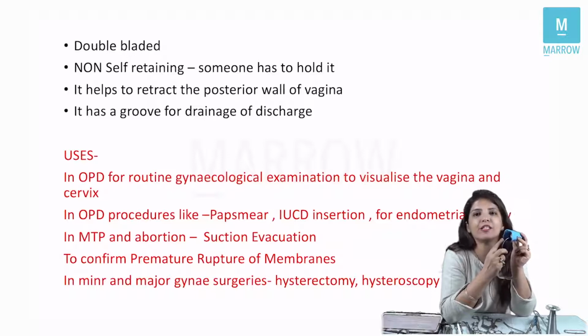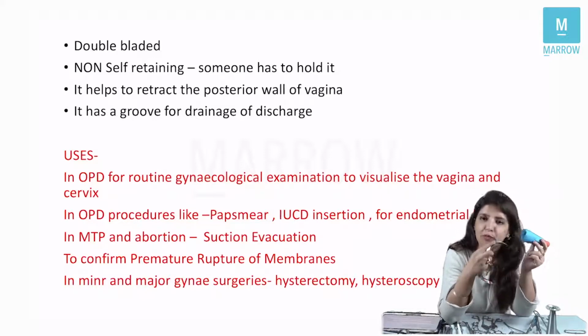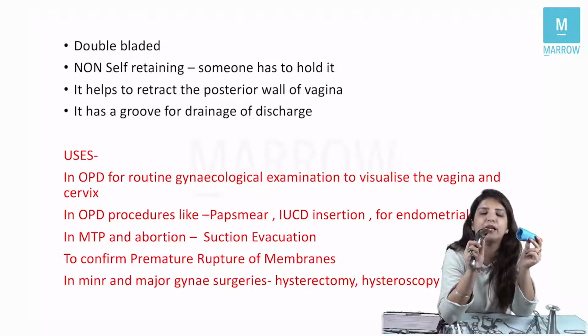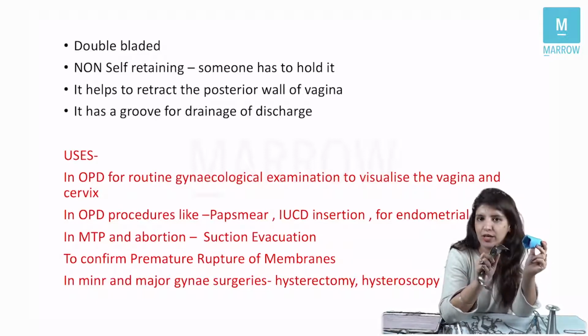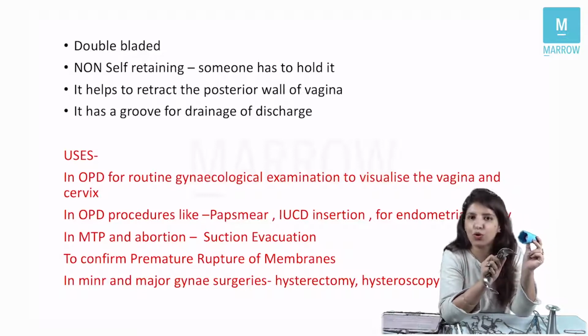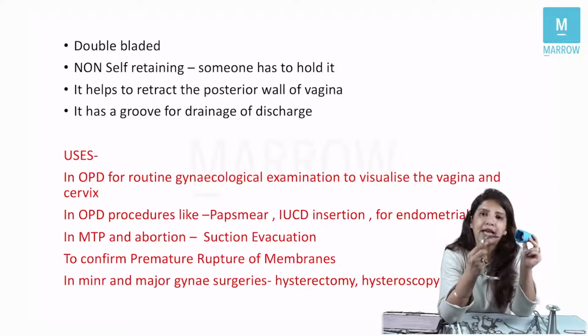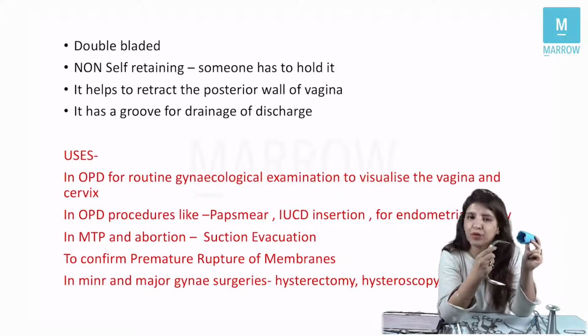And if anterior amniotic fluid can be seen coming out, that means yes, the membranes have ruptured. So, in case of rupture of membranes, whether premature rupture of membranes or otherwise, you can go for a sterile per speculum examination. In rupture of membranes, per vaginal examination is contraindicated, but a sterile per speculum examination can be done, right?